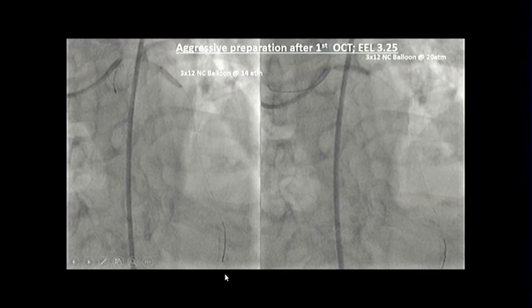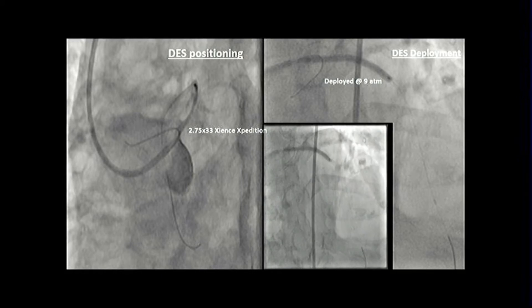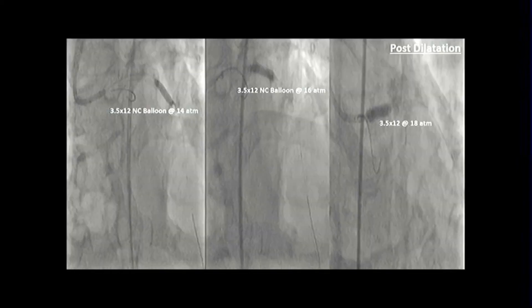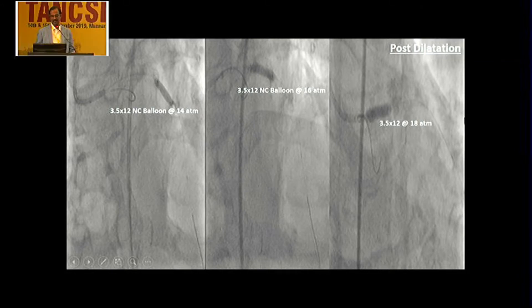With the EEL of 3.25 for LAD and 4 for left main, a 3 into 12 NC balloon was taken at 14 and 20 atmospheres respectively in LAD and left main. A 2.75 into 33 mm Xience Xpedition was placed from the ostial left main, pulled 2 mm into the aorta, and deployed at nominal atmosphere. A 3.5 NC balloon was then used and dilated at 14 and 16 atmospheres in LAD and 18 atmospheres in the left main.